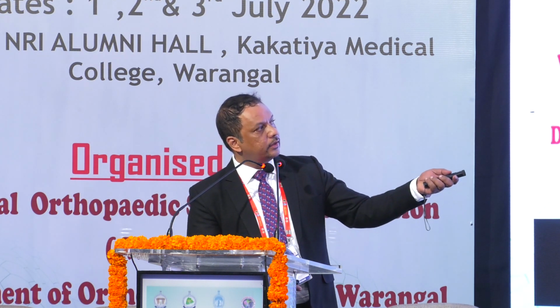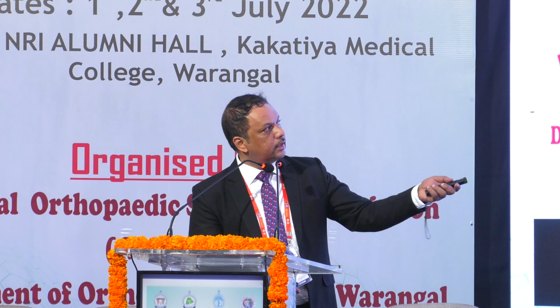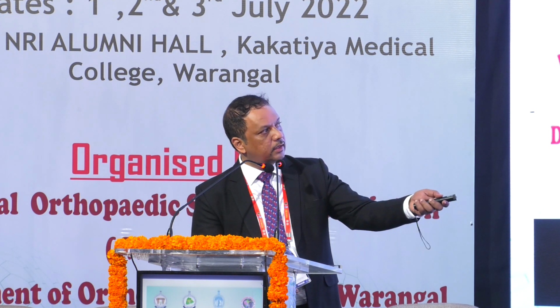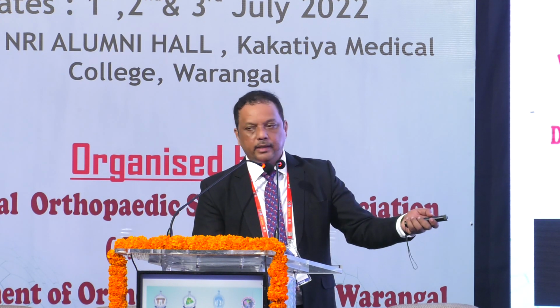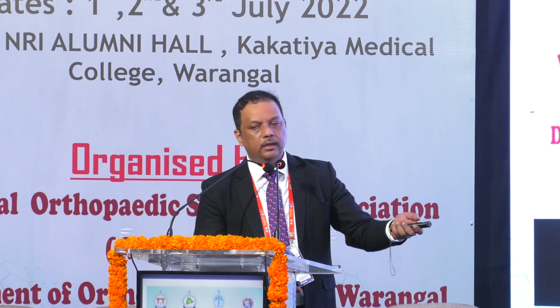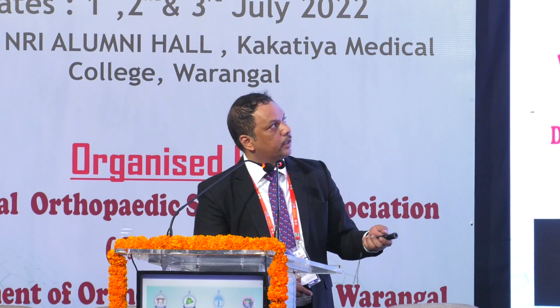Coronal fractures like this, you can have an additional K-wire like this, especially a depressed fracture here at this point, and a split fracture here. Elevate that fragment again with your K-wire, use it as a raft kind of wire here, hold it, and then you can put your plate at that point.